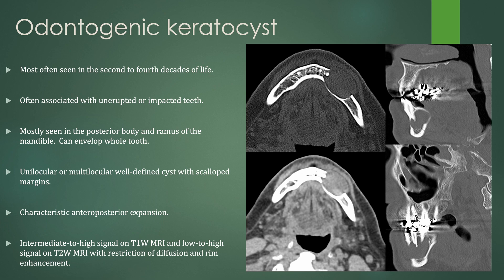Odontogenic keratocysts are most often seen in the second to fourth decades of life. They are also usually associated with unerupted or impacted teeth, but they do not have to be. Mostly seen in the posterior body and ramus of the mandible, and they can envelop the whole tooth within the cyst if large enough. They present as unilocular or multilocular, well-defined cysts with scalloped margins. You can see it pooching out of the cortex of the mandible into the gingival soft tissues. They expand in an anteroposterior dimension as opposed to a transverse dimension. On MRI, these show restricted diffusion — intermediate to high on T1 due to proteinaceous material, and anywhere from low to high on T2 depending on the contents. That restricted diffusion and rim enhancement are characteristic of odontogenic keratocyst.